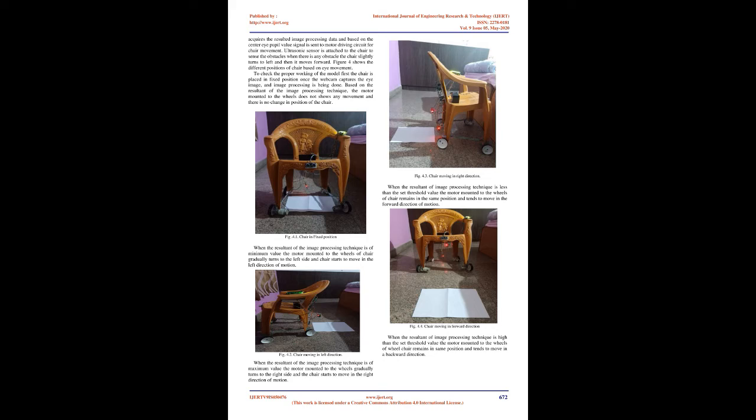For both eye and face detection, the Haar cascade algorithm is used. The camera module detects the user's face. Once the face is detected, it finds the location of the eye and marks the eye region by making use of the Haar cascade algorithm. Both eyes are detected based on distance. B. RGB to gray conversion. Here the image color is converted to cut down delay time in the system. The size of the image frame should be as low as possible because the processor cannot process the frames in a runtime condition. Hence, we use RGB to gray conversion to convert the color image to a gray image.